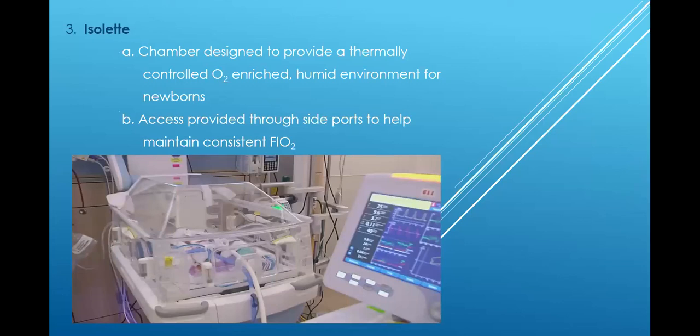The magic box, just get your practice. Make it up tonight. Just say, okay, I'll put my dog on a 60% aerosol mask at 25 liters per minute. And then tell yourself what the total flow is. Just practice and you've got it. It's all the same.